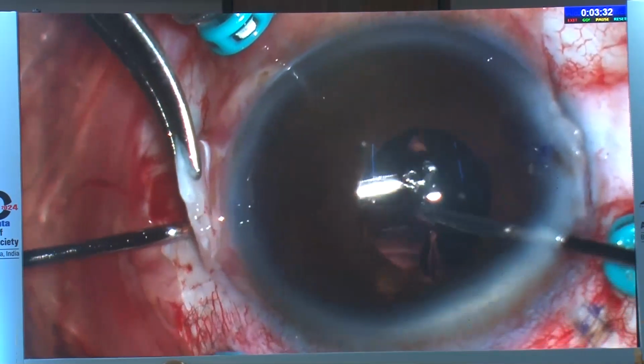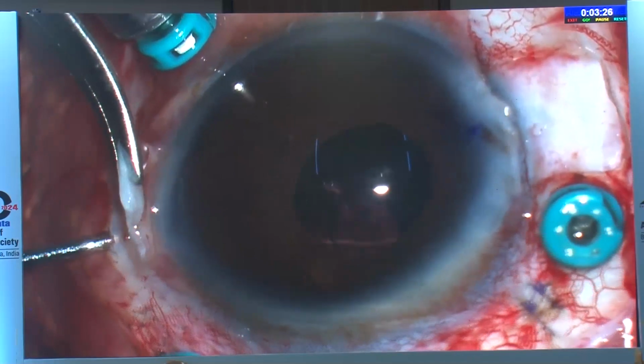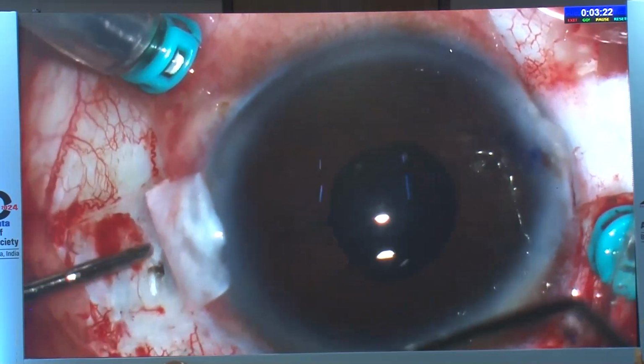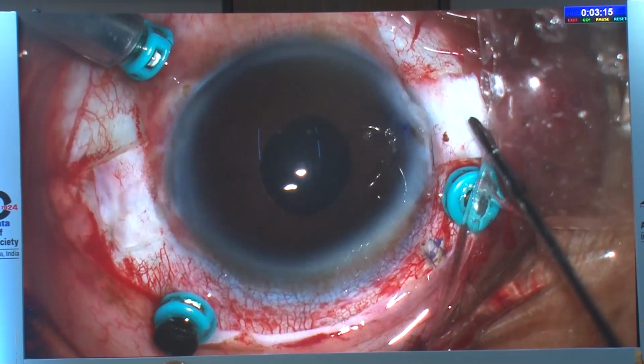Earlier we used to put glue under these scleral flaps or suture the scleral flaps, but in the last 20 cases we have just made the scleral flaps a little bigger and made sure that they are closing this T section, and over that we are just closing the conjunctiva and did not have any incidence of hypotony or anything.